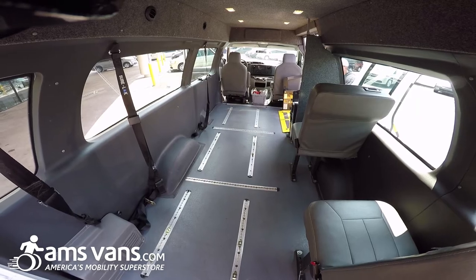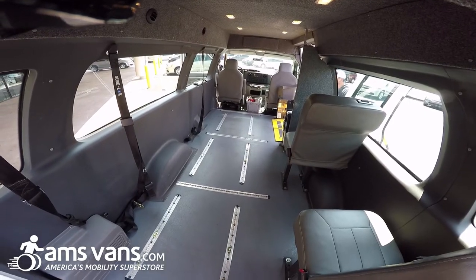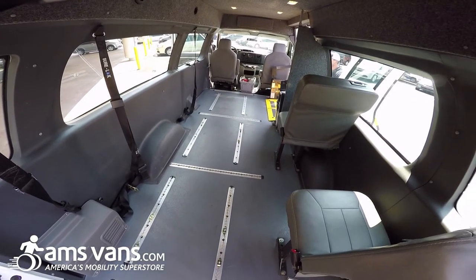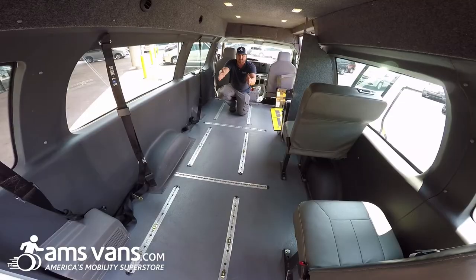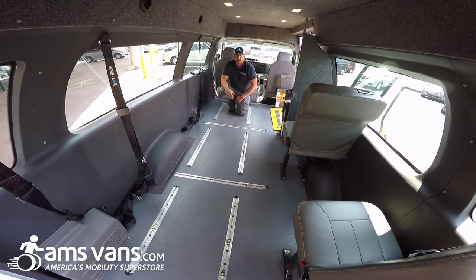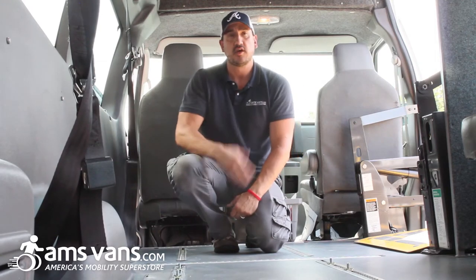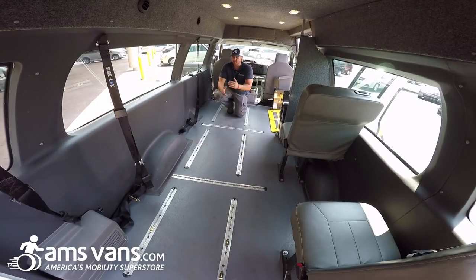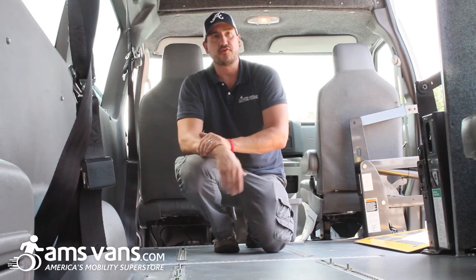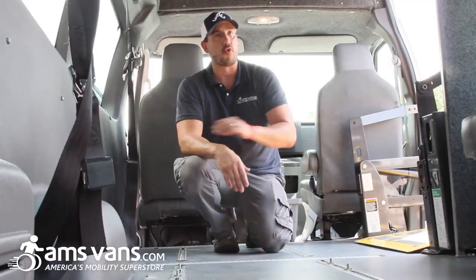We've taken both seats out to give you a better view of the track system. You have the tracks going all the way down the length of the van, and then you have your tracks that go across for your wheelchair restraints. This way you're able to put the seats in different positions. You can have different combinations — two seats and a wheelchair, or one seat and two wheelchairs, whatever you need. You could also have all passenger seats. It's a really cool system where you're able to utilize the whole van for its purpose, whether wheelchairs or passengers.